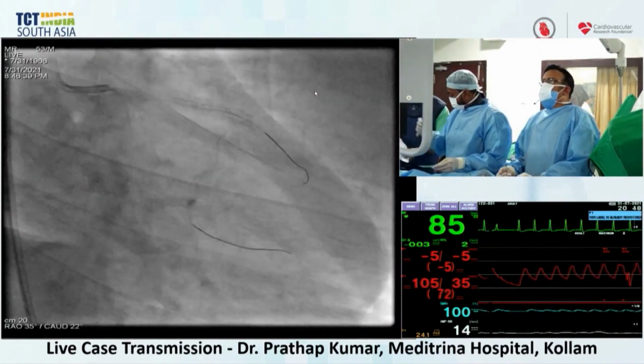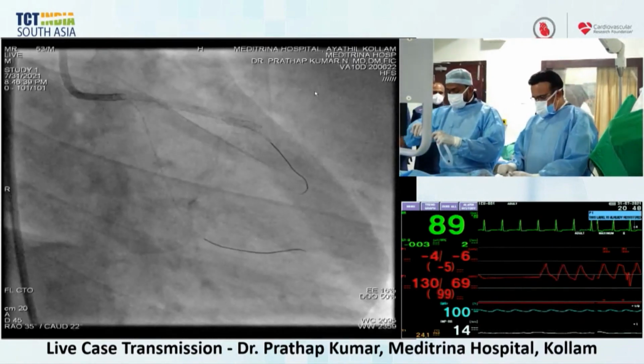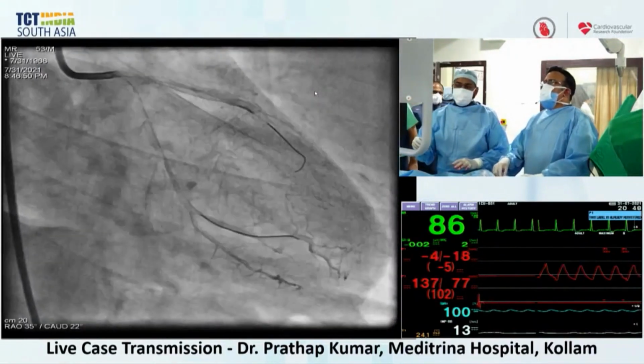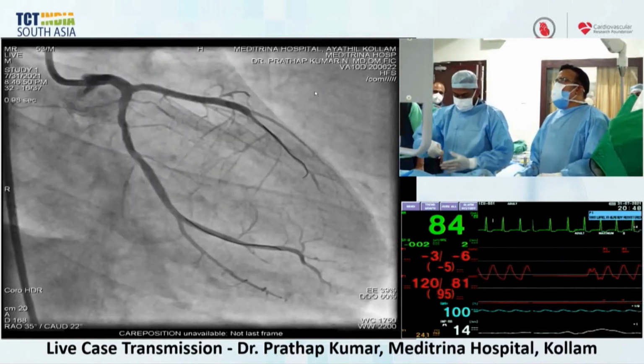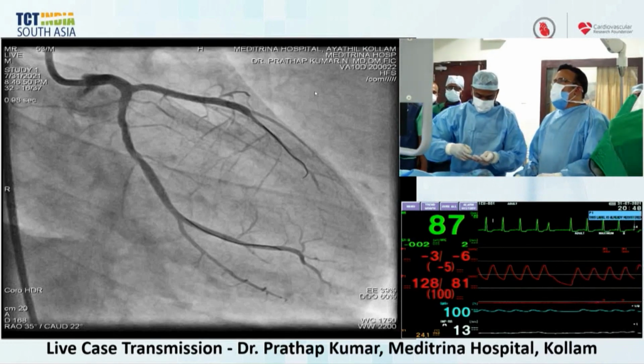I don't disagree with you. I think the point is that we can always use collateral flow to identify whether or not our distal vessel is good, and that works in either direction. So here, that's interesting, right? You have a stent up now, and you still have a fair amount of competitive flow distal, which is unusual when you have a totally recovered lumen in the target vessel.